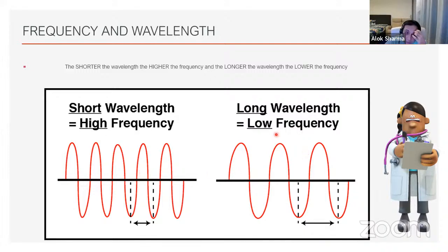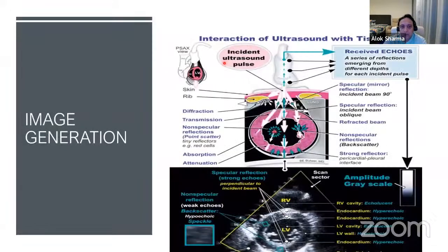Whereas if you look at a low frequency probe, you're able to use a lower frequency, which basically means you're generating less sound waves, which have less attenuation. So they can actually travel a longer distance. And this brings us to the concept of when we use high frequencies, we tend to be able to see the superficial structures much better. And hence the concept for using high frequency in lung ultrasound, especially for extremely preterm and preterm babies, because you really want to be able to focus at the level of the pleural line and superficial structures as opposed to the deeper structures. But as you can see, if you're looking for deep consolidations, that might need a little bit of fiddling around.